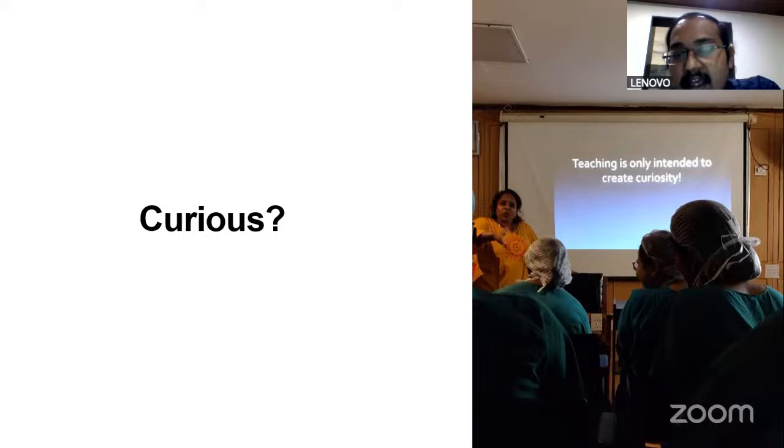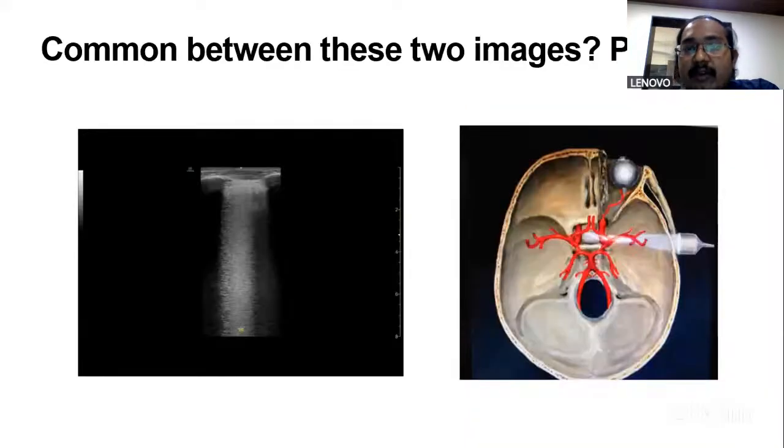So with this, we would like to ask what is common between these two images. One is a lung ultrasound and the second is a transcranial Doppler. The common thing is a paradox where people thought we would not be able to use ultrasound on the lung and skull, because air reflects ultrasound, and the skull will not allow ultrasound to penetrate its thick bone.